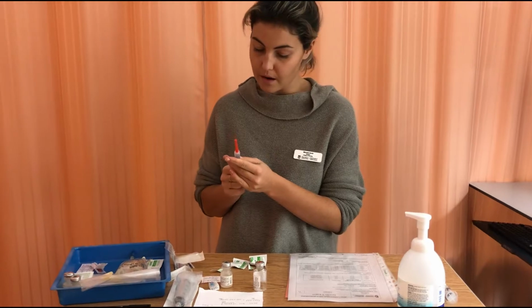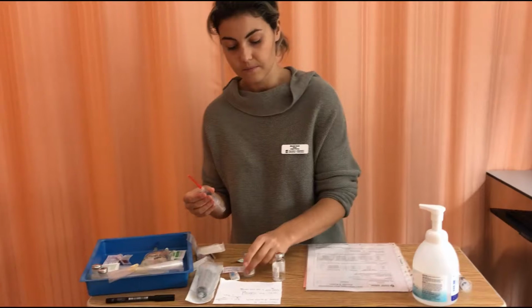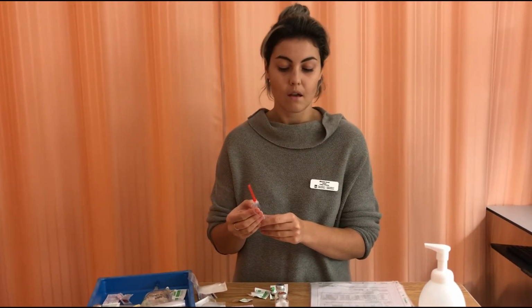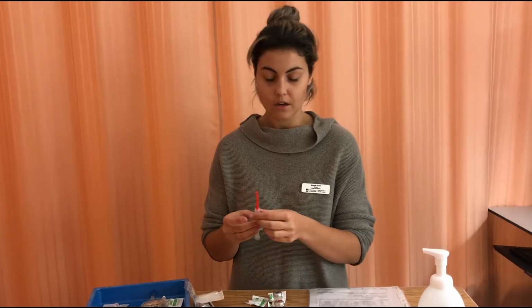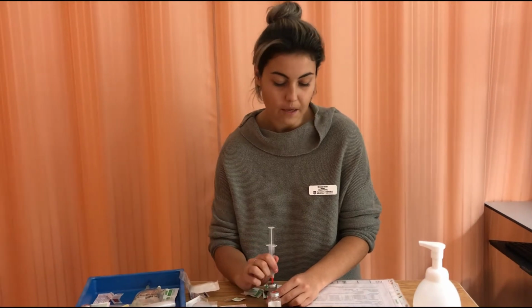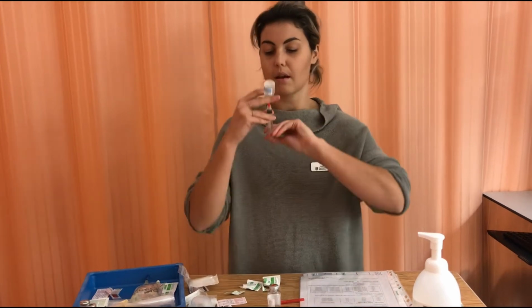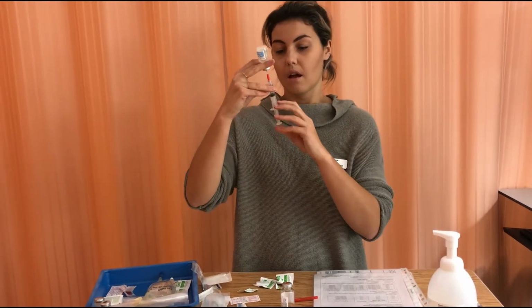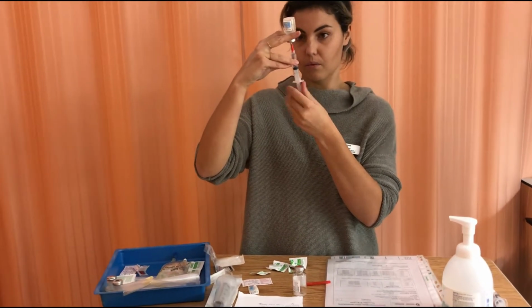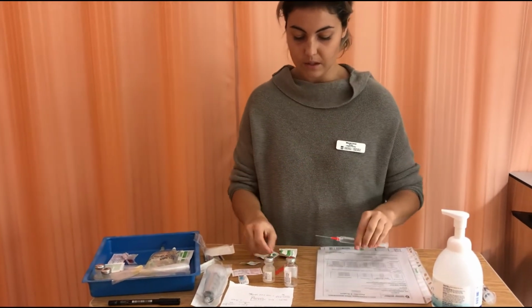So 3.1. Because it is the diluent, I am just making my best estimate to go between the 3 milliliters and 3.1 milliliters. If this were a medication, that would not be an option just because it needs to be more exact, but for the diluent it is appropriate. So I'm just drawing up the 3.1. I'm just going to make sure that I don't have any bubbles in there.